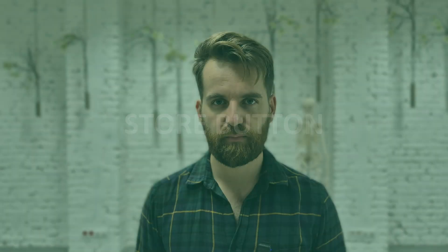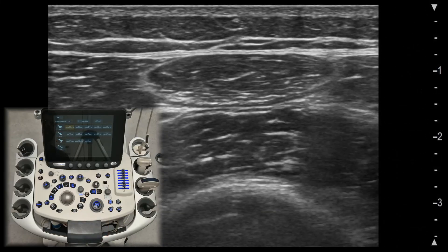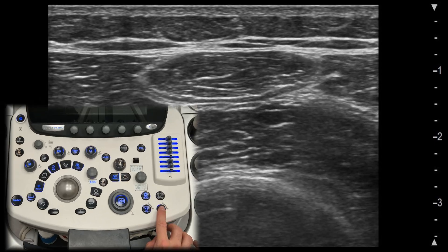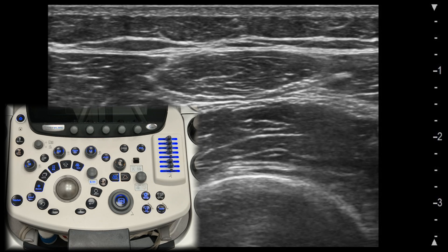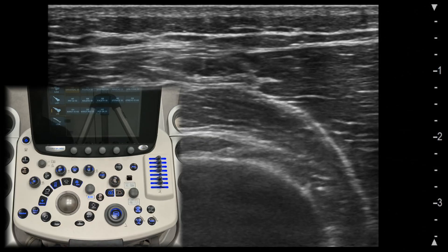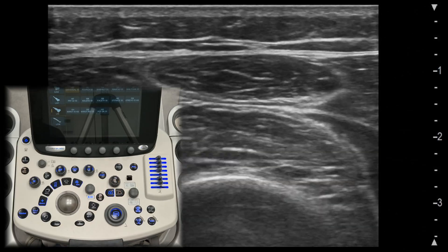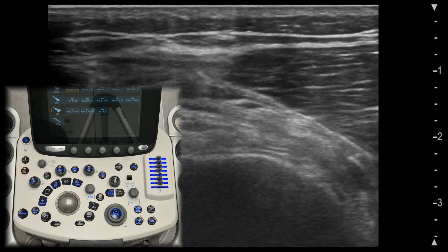Store button. Once you've captured the perfect image, you will want to save it for documentation or further review. The store or save button allows you to archive images directly to your system or machine memory. Clip button. If you want to save clips, press the clip button. You can set the clip to save either forwards or backwards in the settings.